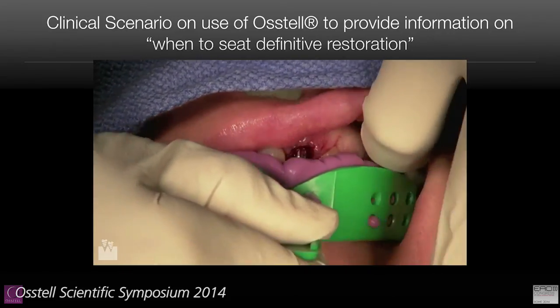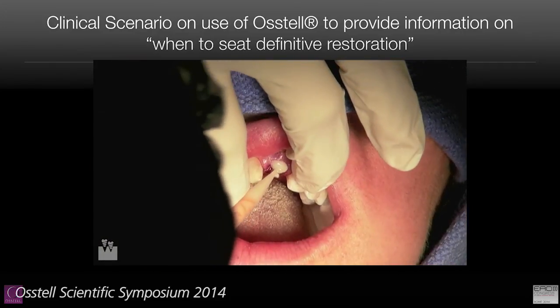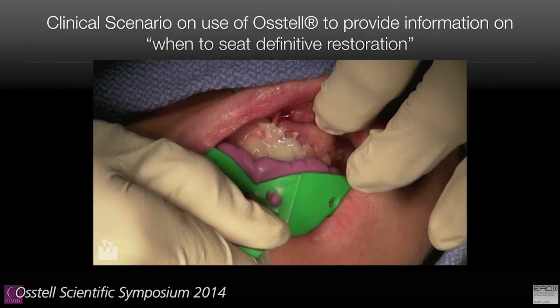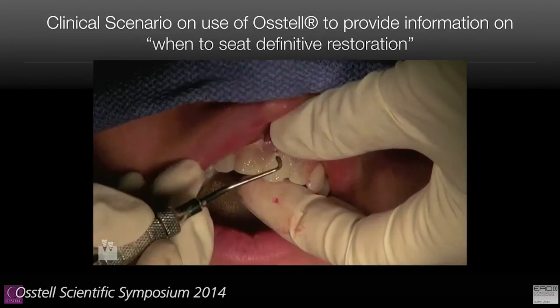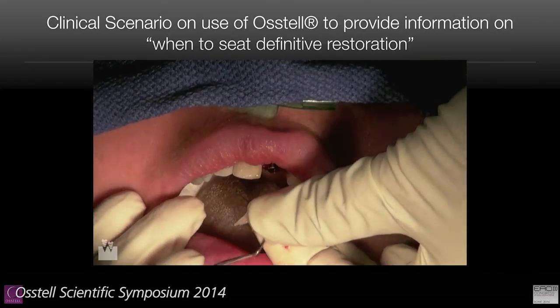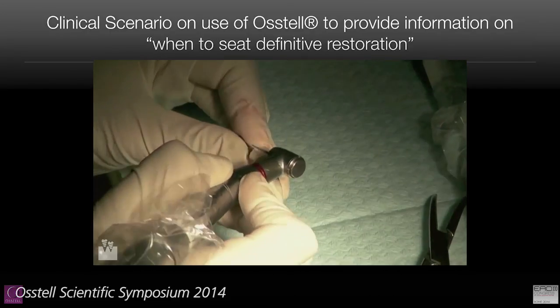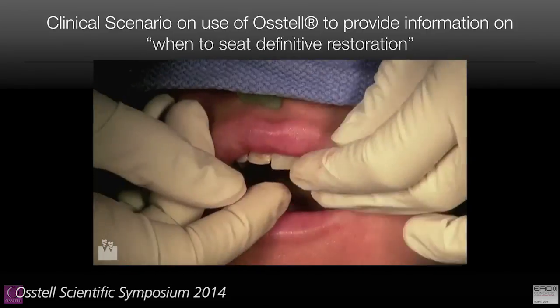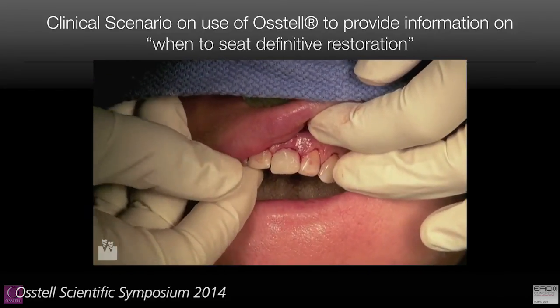And so at this time, we hand our patient over to our Prosthodontist colleague to fabricate the provisional. Now, in this phase of treatment, we want to make sure that we minimize the removal and reinsertion of the abutment. And the reason why is because, remember, that implant that we just placed has only mechanical stability. And as you all know, if you've inserted a screw into a piece of wood, the more times you back that screw out, the looser it becomes.